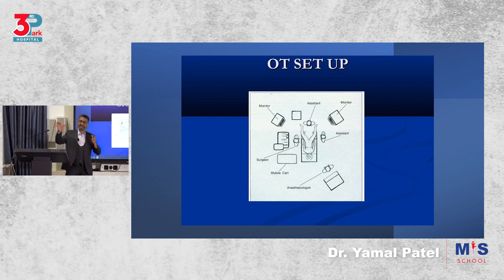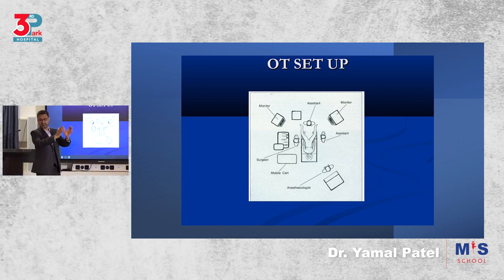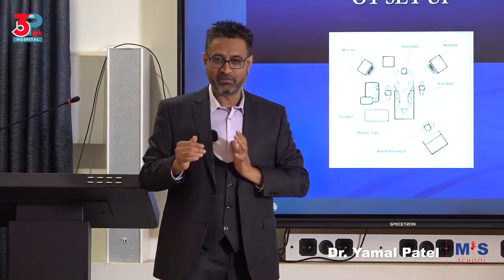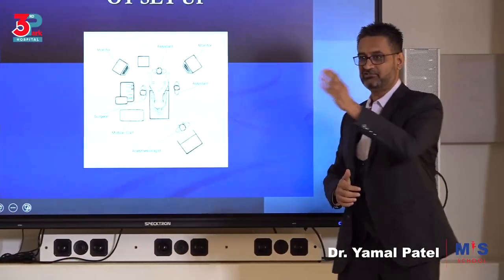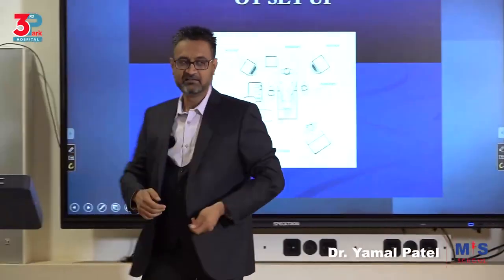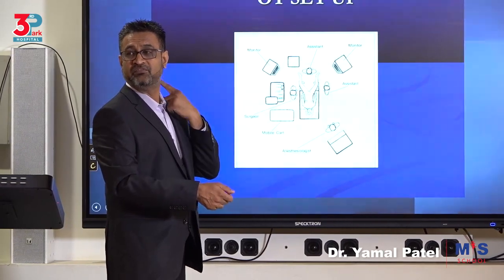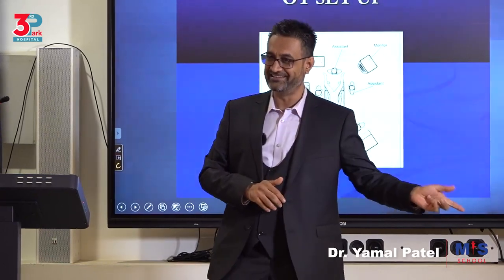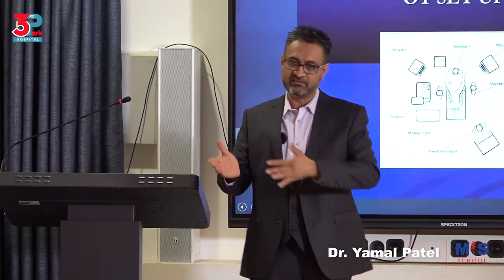We have ideally 2 monitors, one facing the surgeon, one facing the assistant. If you have only one, then try and bring it between the legs, so don't leave it on the side of the surgeon, because I am the surgeon, so I should see. What about this other person? What will they have to do? You get what I'm saying? You do this for 15 minutes and your neck is gone. And trust me, you'll forever curse that surgeon for giving you a neck issue. So try and be considerate.